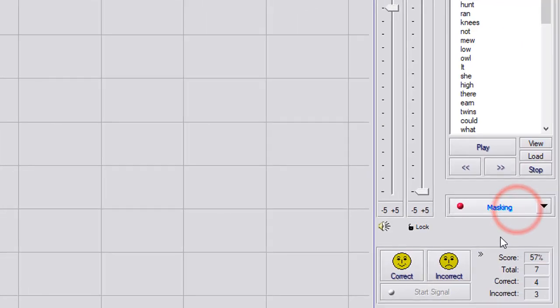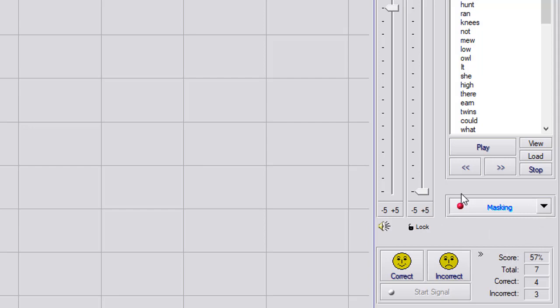Below that, we have masking, which again is the same as your air conduction at the beginning of the test. Masking is turned on.